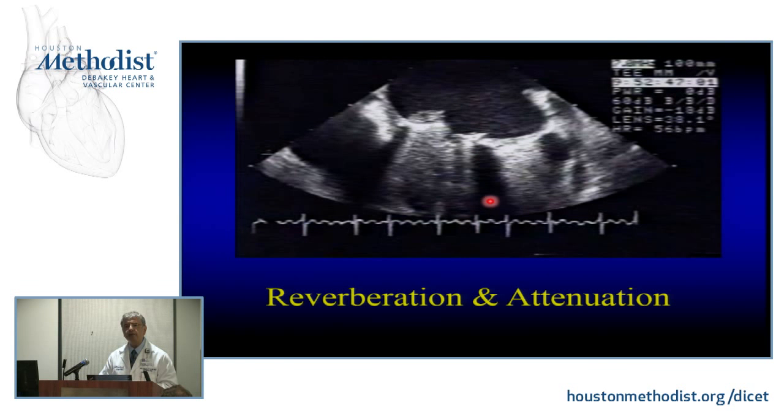This is an example of attenuation, meaning I have a very highly reflected area, which is the annulus basically of this, or it could be a piece of calcium in somebody with calcification. Ultrasound comes here. Most of it gets reflected back up, and there is very little that goes down. Remember the reflection and refraction. If you don't have refraction, meaning going further down, you're not going to be able to reflect back again, right?